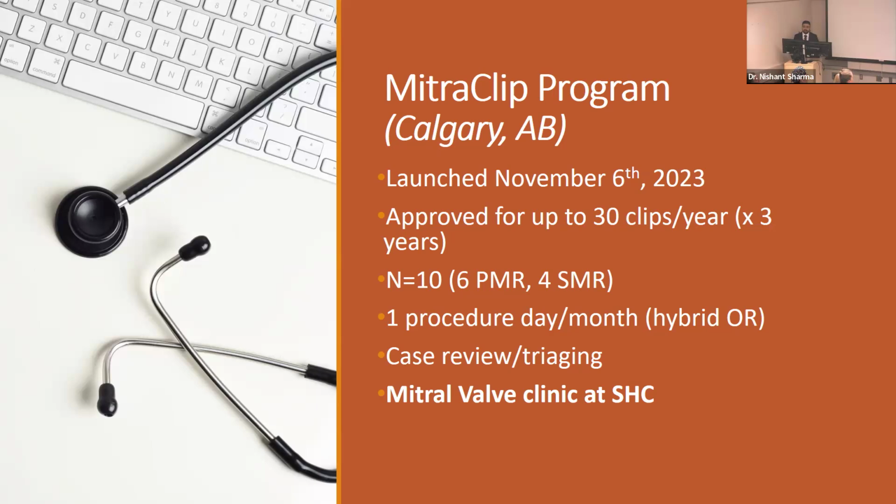We've done 10 up to date, which is pretty mixed between primary and secondary MR, with pretty reasonable outcomes considering we have taken on more challenging cases for an early center. I'd say just over half have mild to moderate residual, and a couple may need a repeat clip, which is not uncommon. But overall, we're pretty happy with the result.